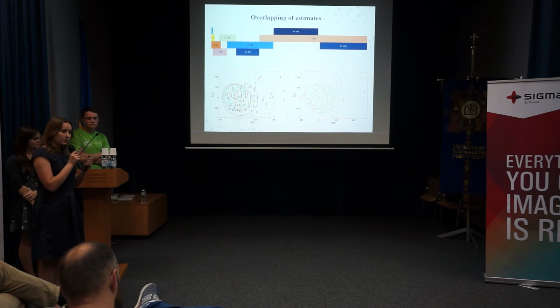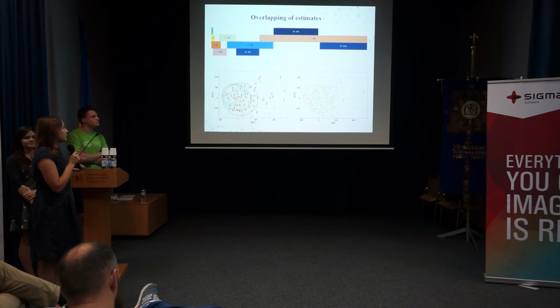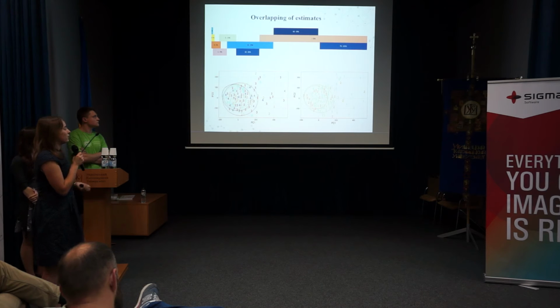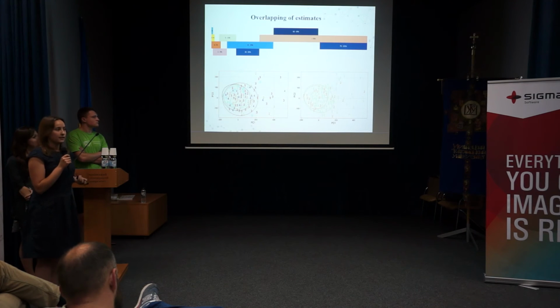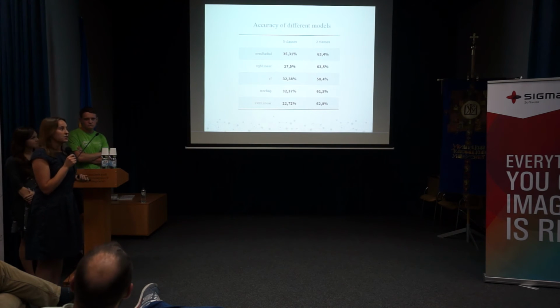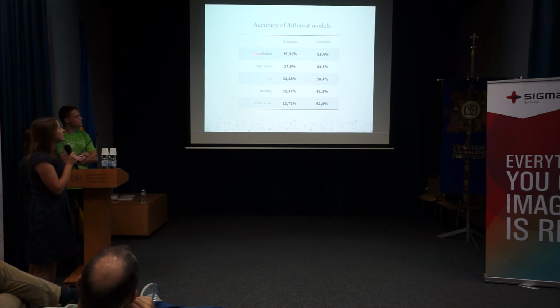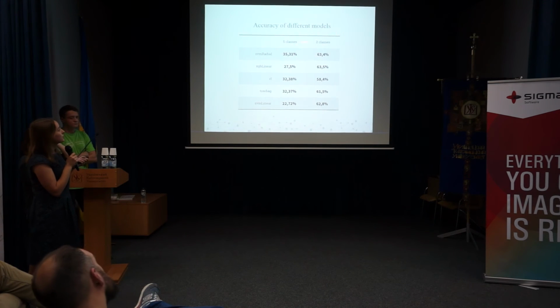In order to reduce dimensions of our data, we applied the PCA analysis to our data matrix, and as you can see, we also didn't get a big distinction between all classes. Then we split our data into training and testing set, and applied a caret package to train our model. We used the 5 most popular algorithms from the caret package, and here you can see the results on the testing set for our 5 classes and for 2 classes.